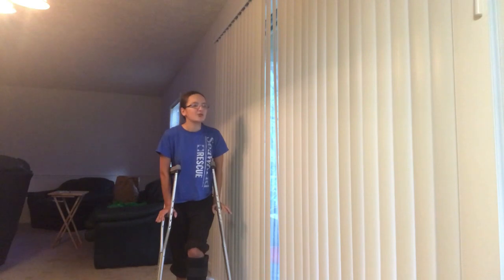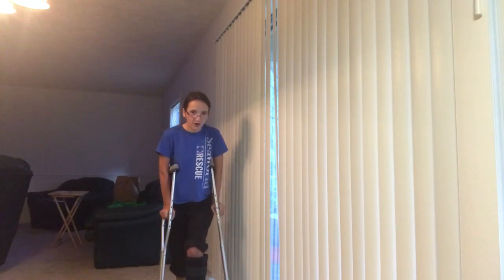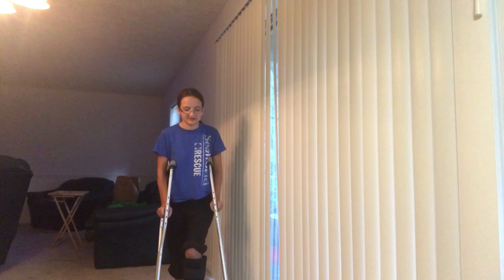But over time, your arms will adjust. They don't hurt much anymore unless I go long distances. And you're going to avoid all those problems with your underarms. So I will show you guys now and walk back up to the camera. Use your forearms to take the weight, not your armpits.